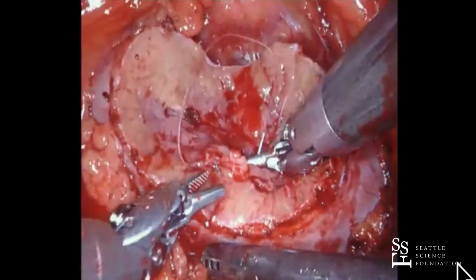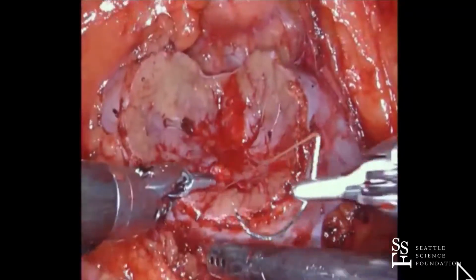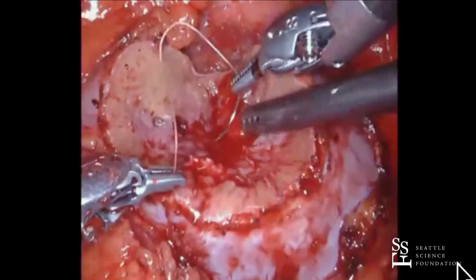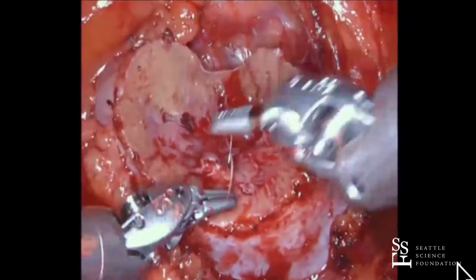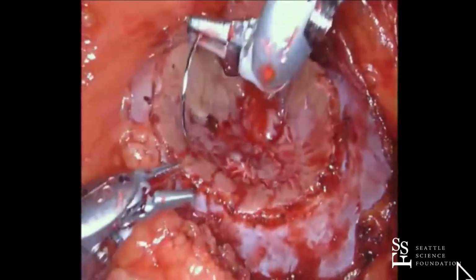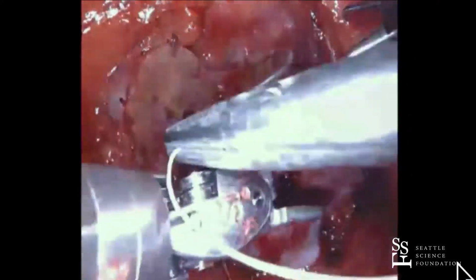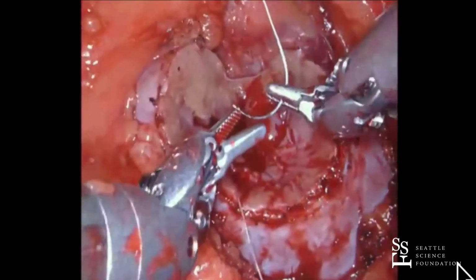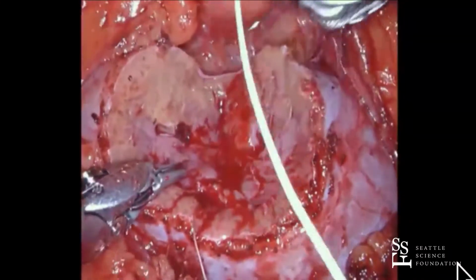Definitely an artery right there. You guys can see that artery right there? Yes, absolutely. Beautiful. That's the one right there that's going to give us trouble if we don't get it. Give me another stitch, give me another short, please. And this is a similar concept to what Ronnie talks about, where I kind of run, so right here, there's a little vessel right here, please.